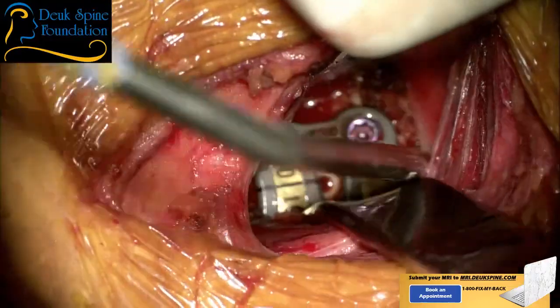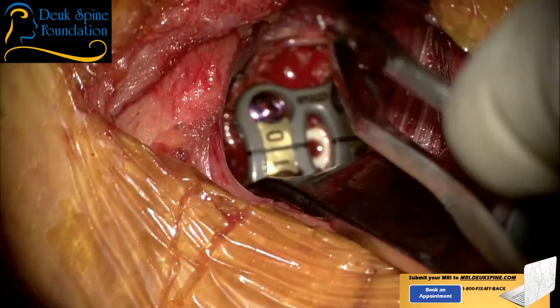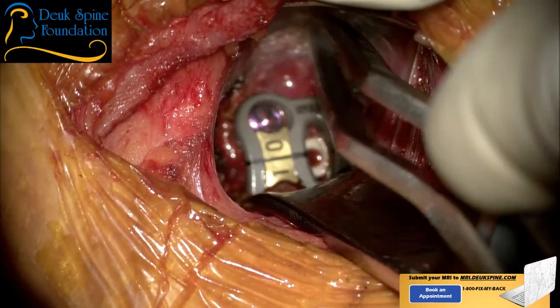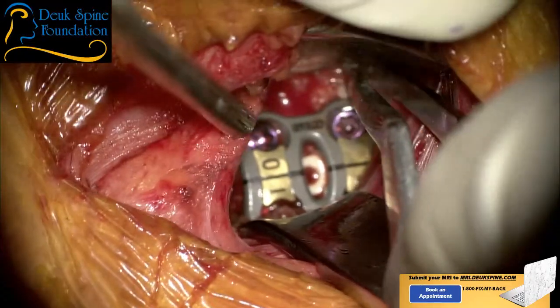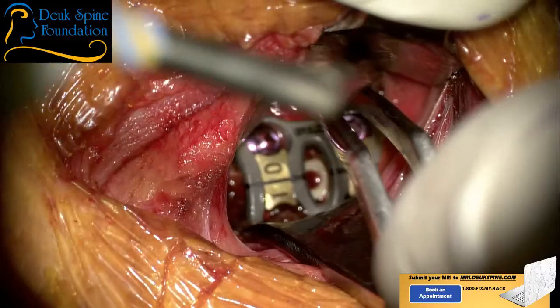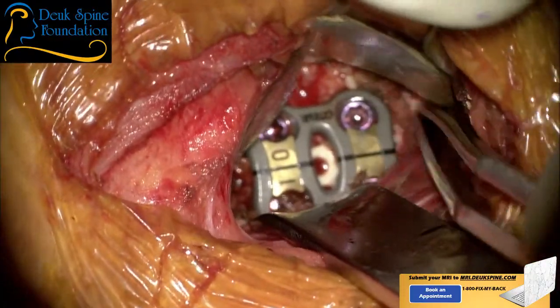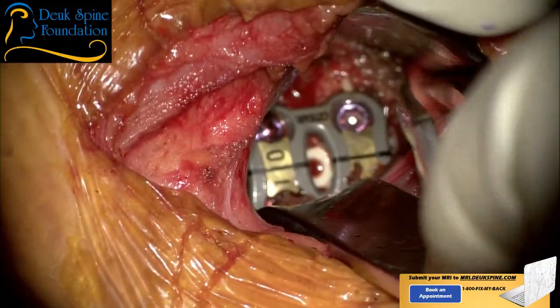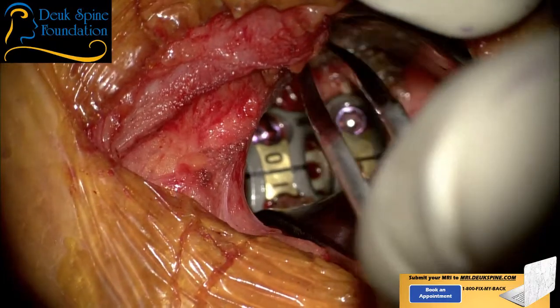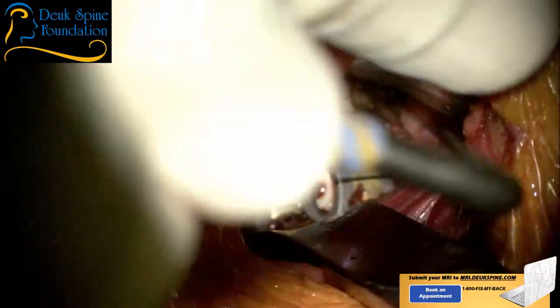Hold this, Luis. Right here. Okay. Let me have yours, Patel. Give you a little break. Suck for me. All right, that's good. Okay, you want it back? This is where you always get into trouble with a little bit of bleeding, just in the corners here. Okay, you got it?